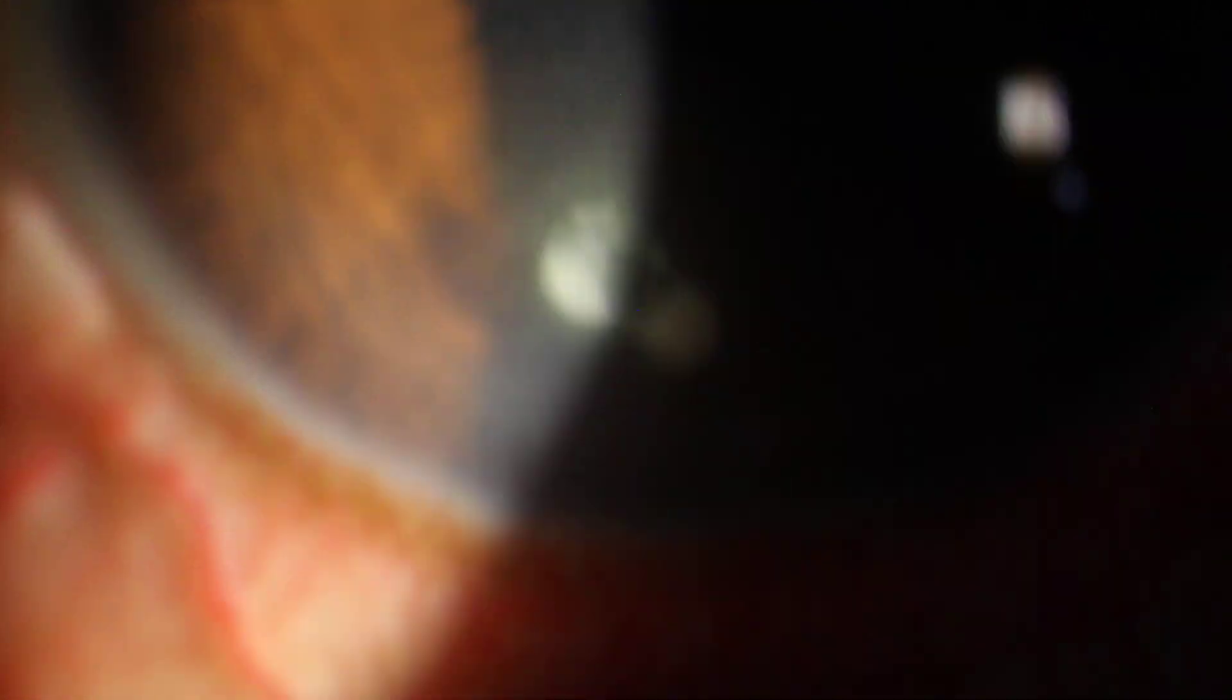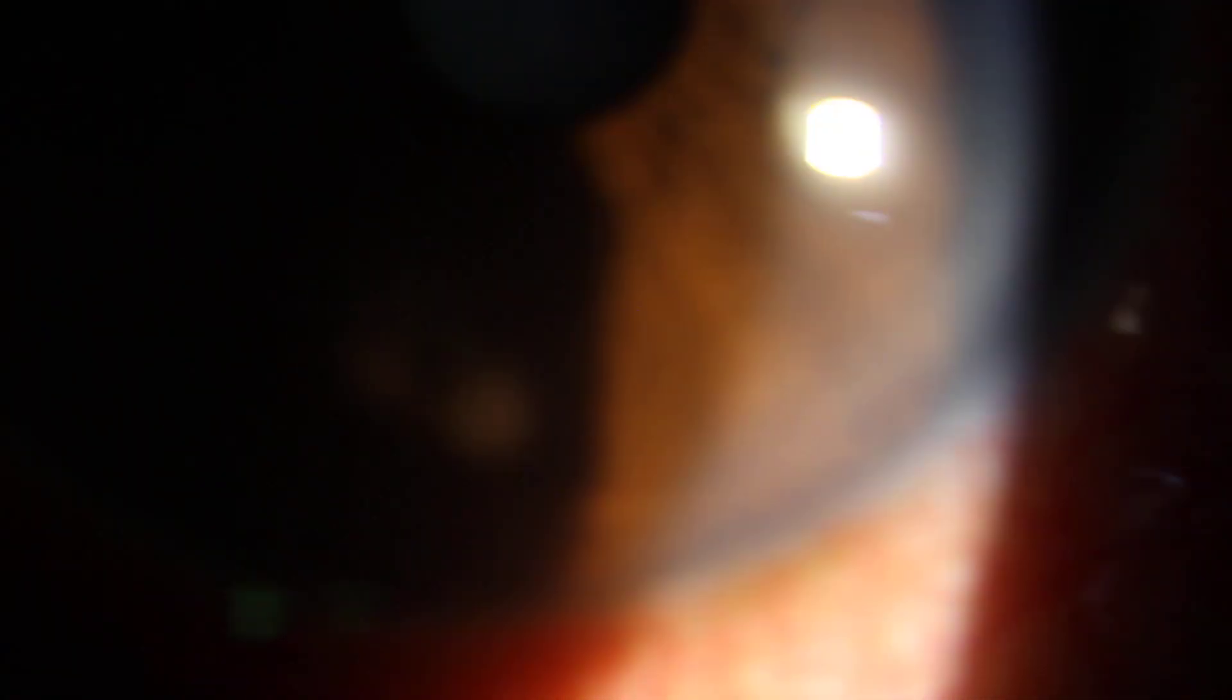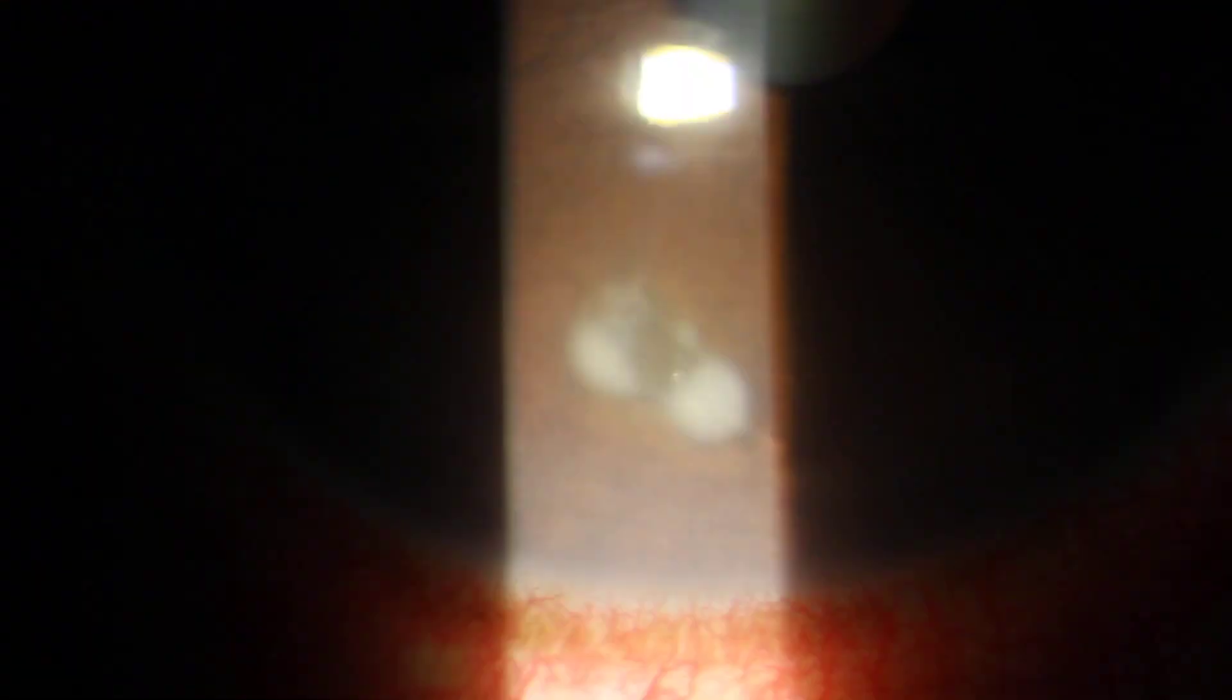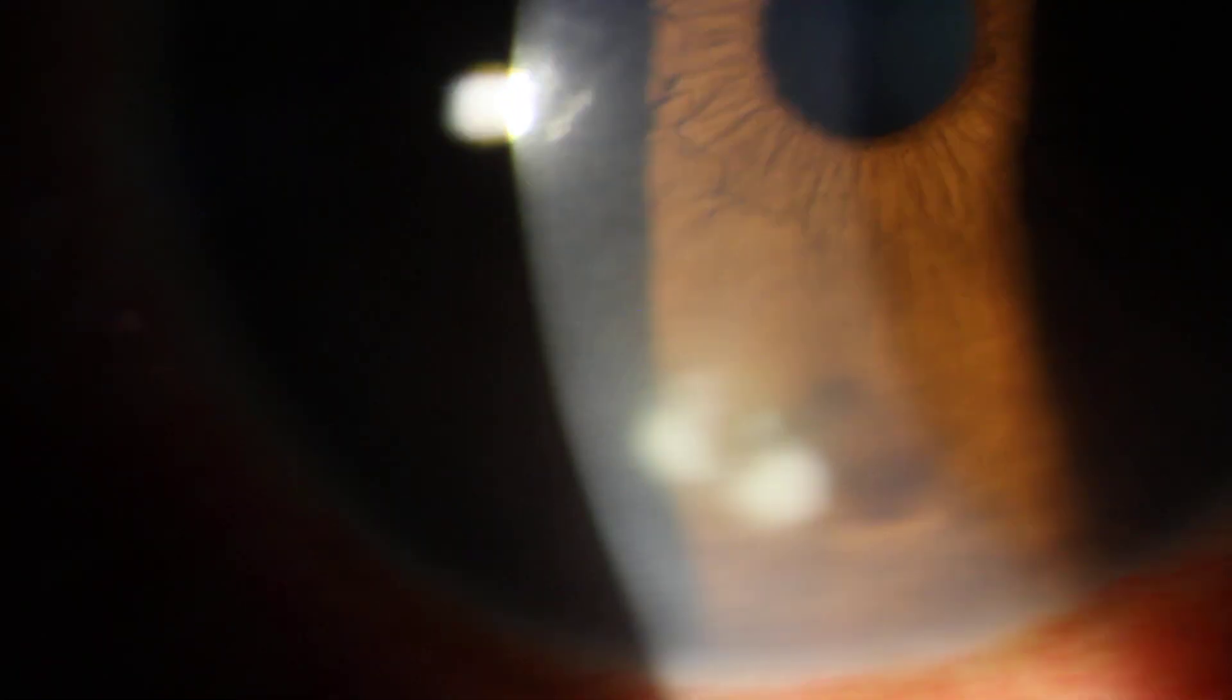I'm gonna see if I can clean it up. Yes. Oh, we'll do forehead all the way on that. There you go. That's great. There we go. Good.